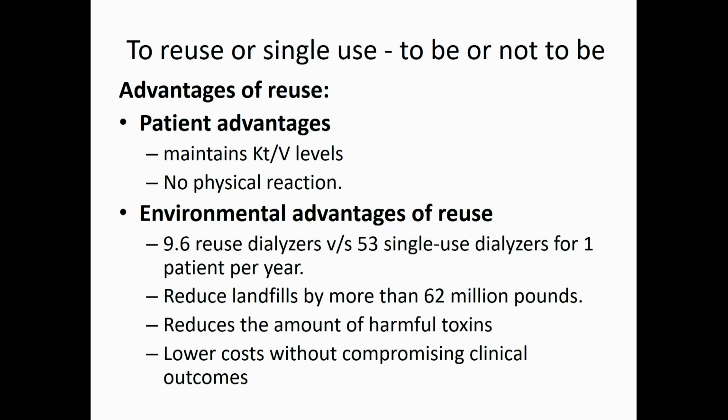There's another thing. You have a database. So you enter that this is the dialyzer I'm using, say F8, and its fiber bundle volume is 110. Now if you want to do it with each and every dialyzer, you'll have to change the database every time, which is again practically, see, we are not talking just the books, we are talking practical. So it is extremely difficult to measure the first fiber bundle volume of each individual dialyzer in a busy unit.